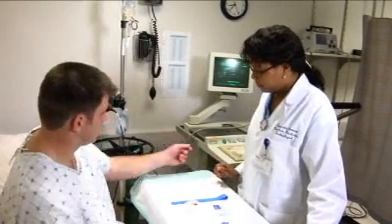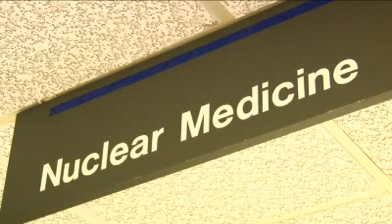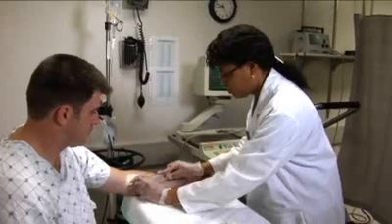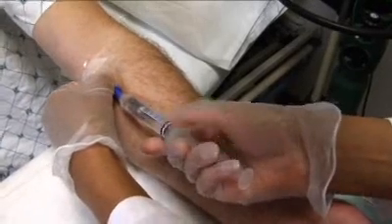What is a stress nuclear test? A cardiac nuclear study or heart nuclear study is a test that uses a small dose of radioactive solution to track blood flow to the heart muscle and to evaluate heart function.